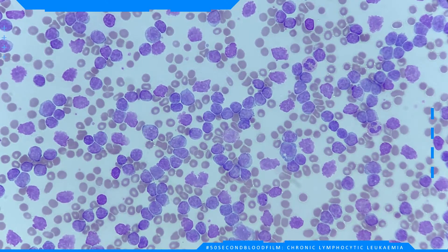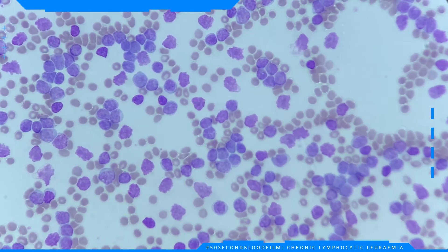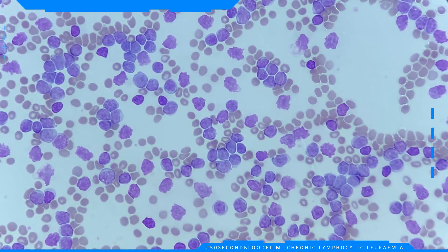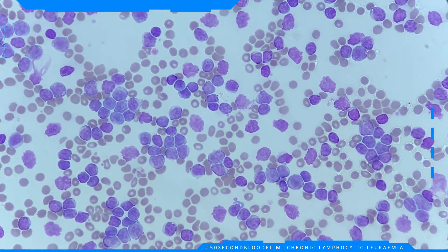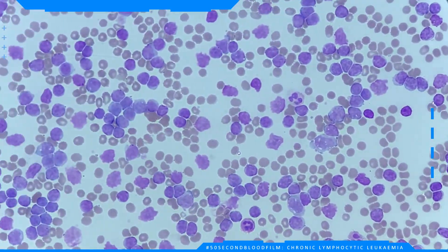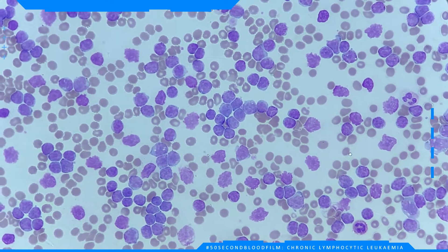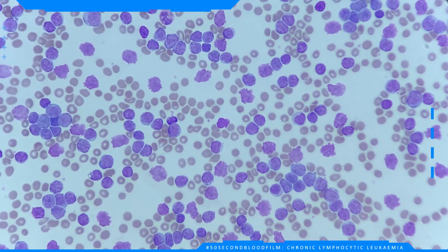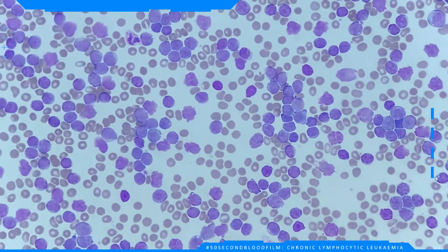As can be seen, most of the white cells present are lymphocytes with very few other cells noticed. Some of these lymphocytes have normal morphology, whereas others are slightly larger in size, with angular nuclei, and have a more grey-blue cytoplasm that in some cases touches the red cells around it.